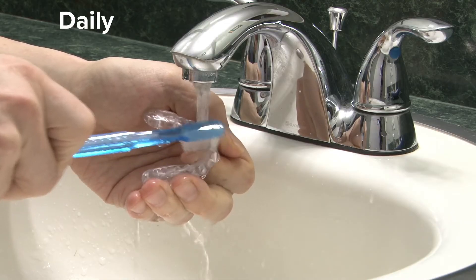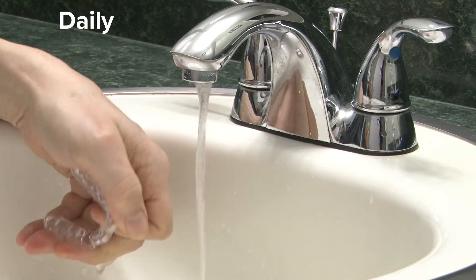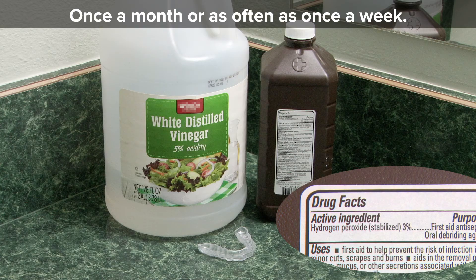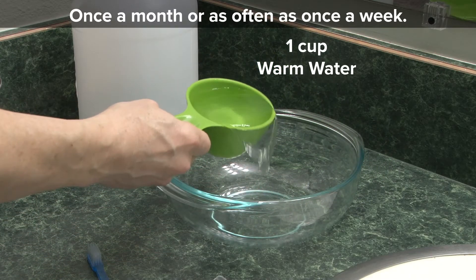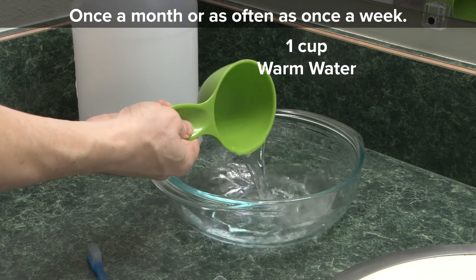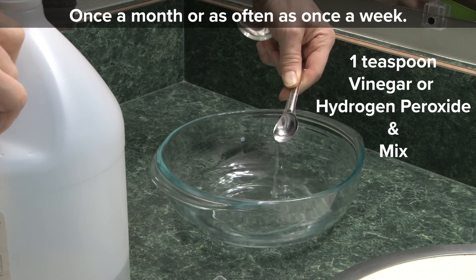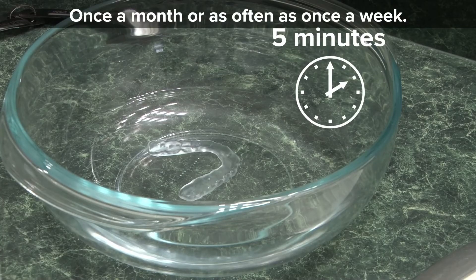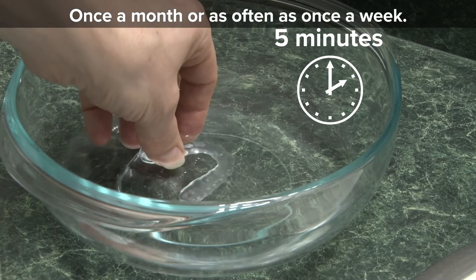In addition to this daily cleaning, you should do a deep cleaning at least once a month or as often as once a week. To do the deep clean, you'll need to mix a cleaning solution out of either distilled white vinegar or hydrogen peroxide. Pour one cup of warm water into a glass bowl, and then add one teaspoon of either the vinegar or hydrogen peroxide, and mix. Place your night guard into the bowl and let it sit for five minutes.